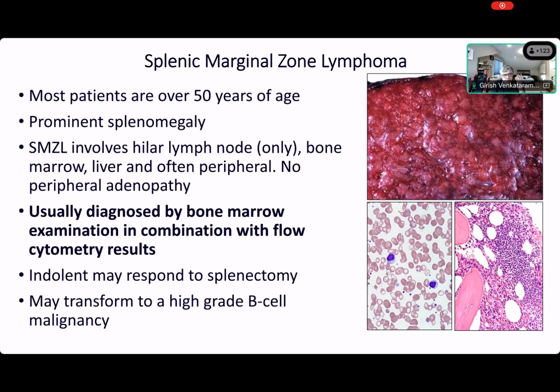If you see the classic pictures of fuzzy cytoplasm in the peripheral blood, you may be able to diagnose hairy cell leukemia. But hairy cell leukemia is also not easy because it will present with pancytopenia and the number of circulating cells will be quite few in the peripheral blood. So it's very easy to even miss hairy cell leukemia on a peripheral smear if we do not have a flow, right? But in most splenic marginal zone lymphoma, the counts are usually normal or high. So the circulating cells are usually easy to see in the blood, right? If it's too easy to see, I would not even think of hairy cell leukemia typically, because it usually doesn't present with high counts, right?